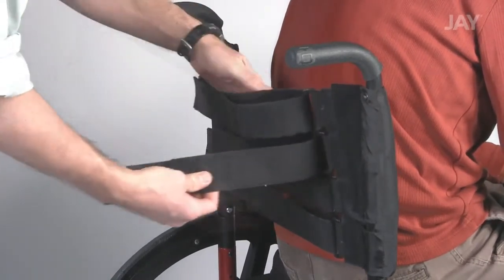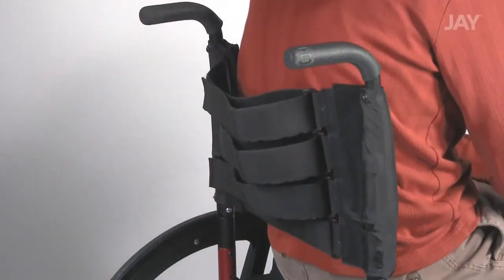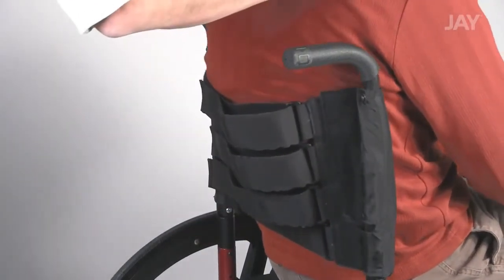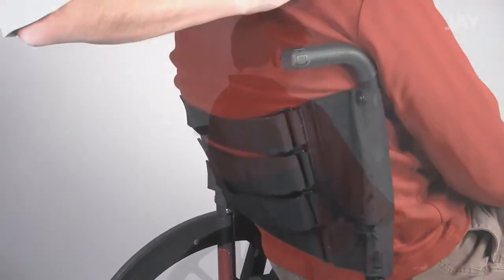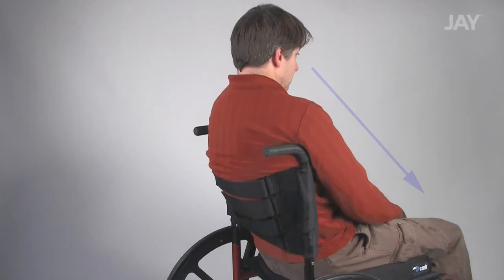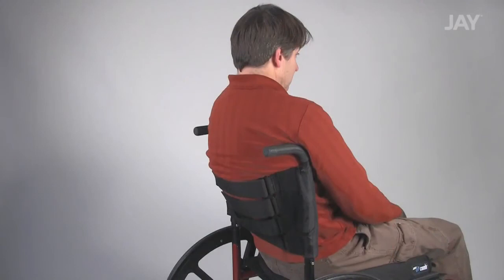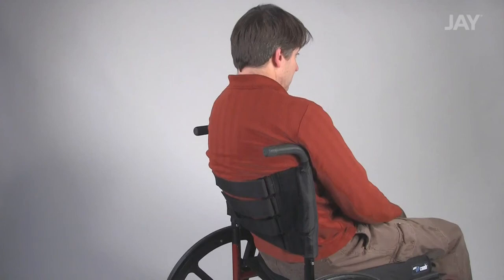When the user is eased back into the seat, his field of vision moves from a downward direction to eye level. This is just one example of how these straps can be adjusted. Obviously, there are many other potential configurations.